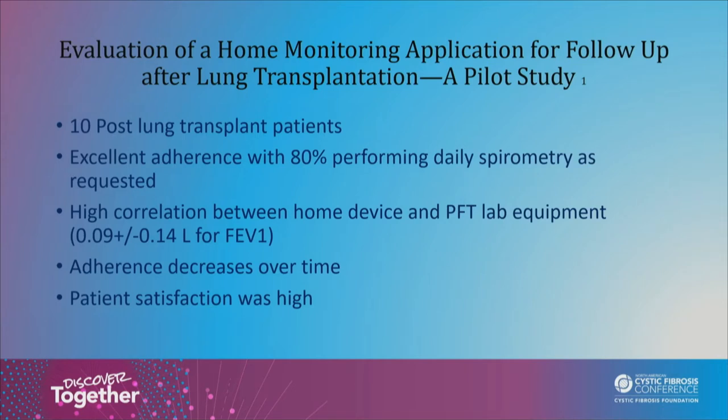And this is a good study to include because it points us towards highly motivated patients that have a really good relationship with a care team, that spend a lot of time in contact with their care team. It's a small study of only 10 patients, and what to me was the most amazing thing is that they asked their patients to do spirometry every day, and 80% of them, especially initially, did that. They did it every single day, which is pretty amazing.